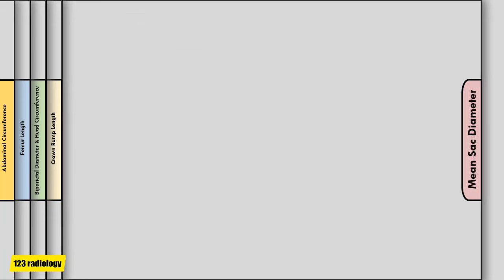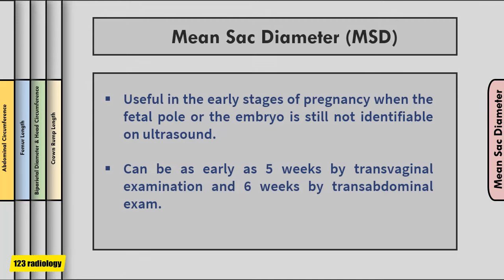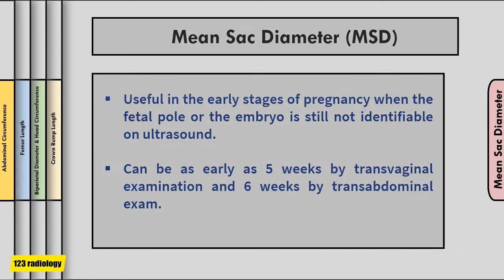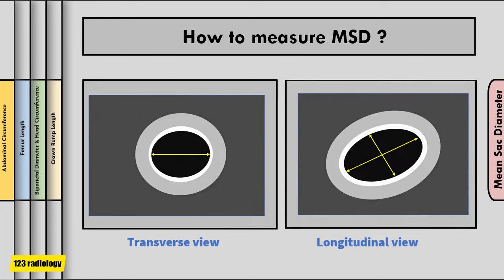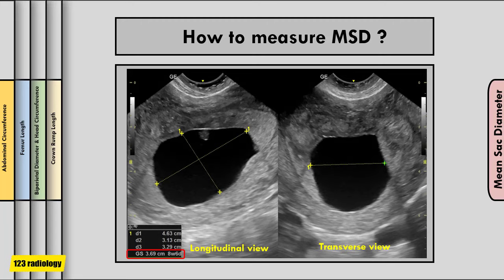Let's start with the mean sac diameter. This parameter is useful in the early stages of pregnancy when the fetal pole or embryo is still not identifiable on ultrasound — this can be as early as five weeks by transvaginal examination and six weeks by transabdominal exam. To measure mean sac diameter, obtain longitudinal and transverse views of the gestational sac. On the longitudinal image, measure the length and height, and on the transverse image measure the width, only measuring the anechoic area and excluding the echogenic rim.